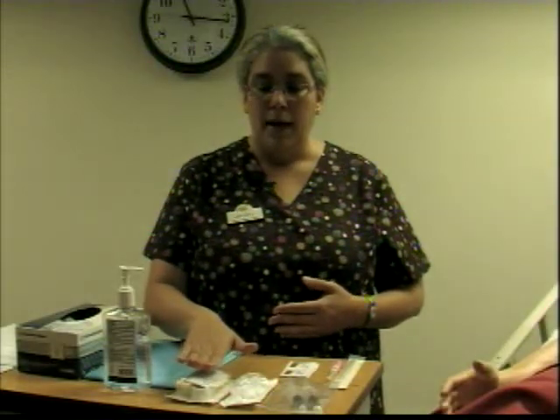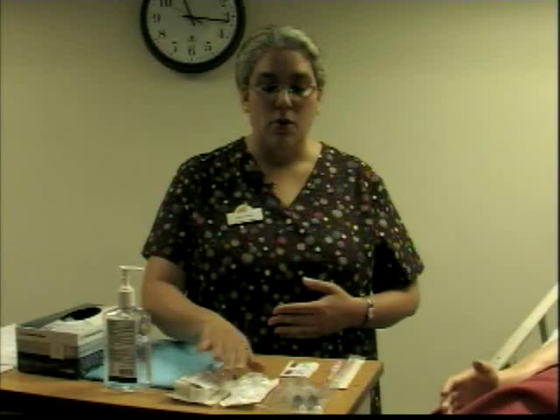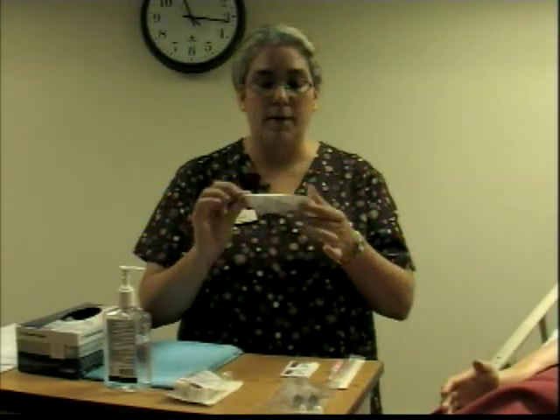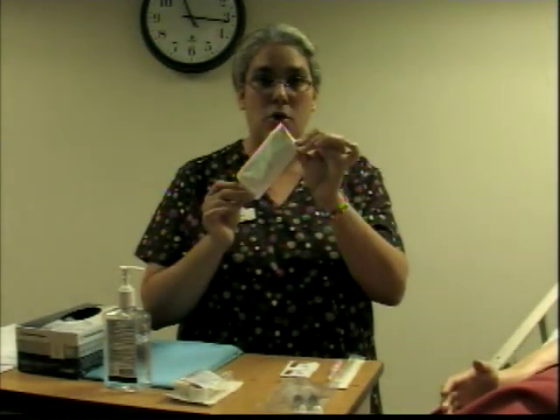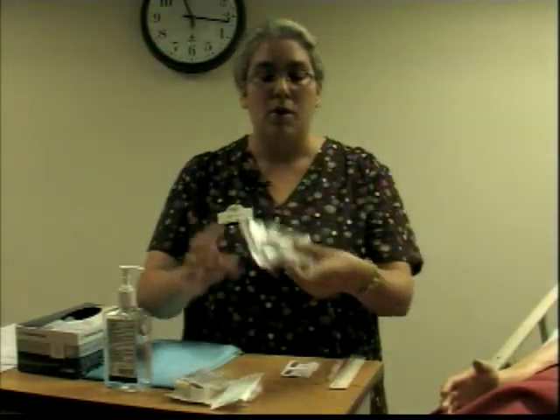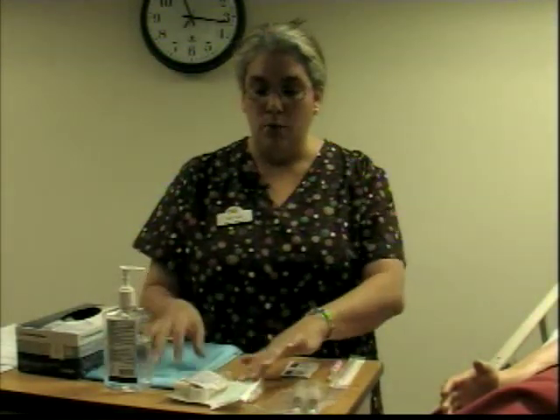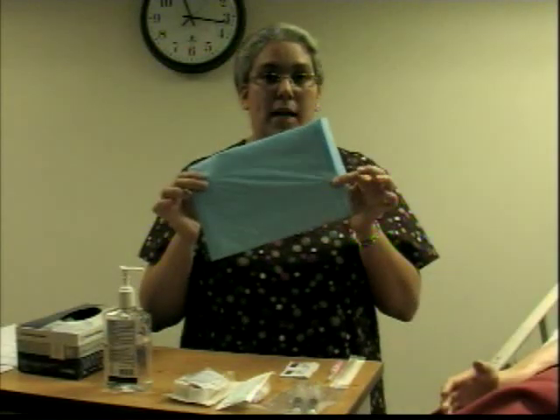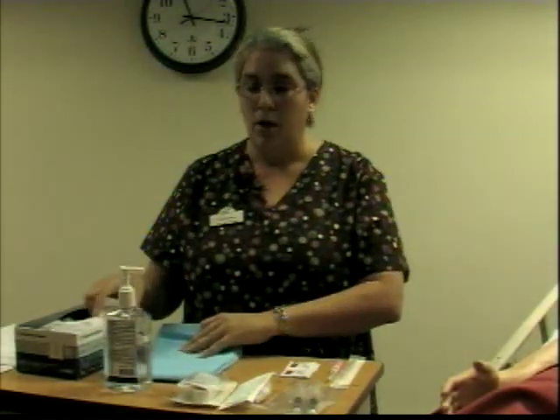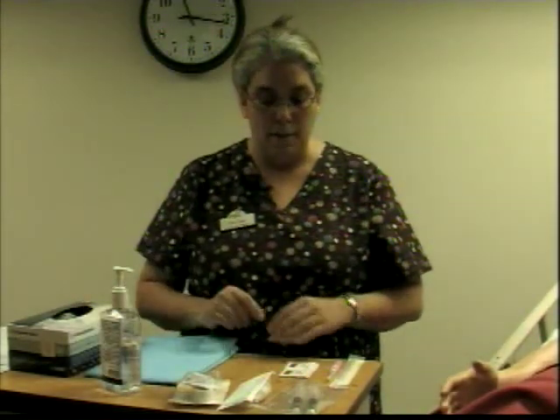There is a pre-packed IV start that your institution will have. Then you have your extension tubing, which you're going to prime with saline and connect your IV fluids to. You have your saline flushes, which will be labeled as such, and you want to make sure that it is saline. You have a blue chux that can help you collect any blood that you might spill. Of course, your gloves, your hand sanitizer, wash your hands before you come in, and any extra supplies that you think you might need.